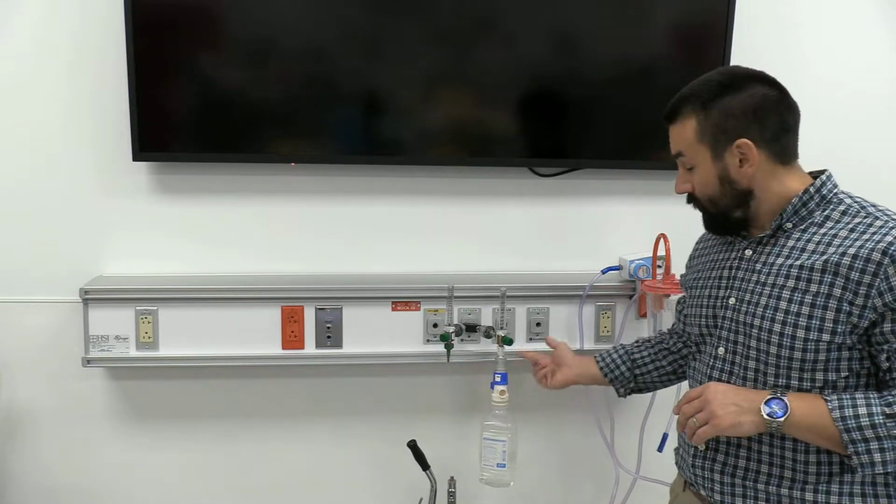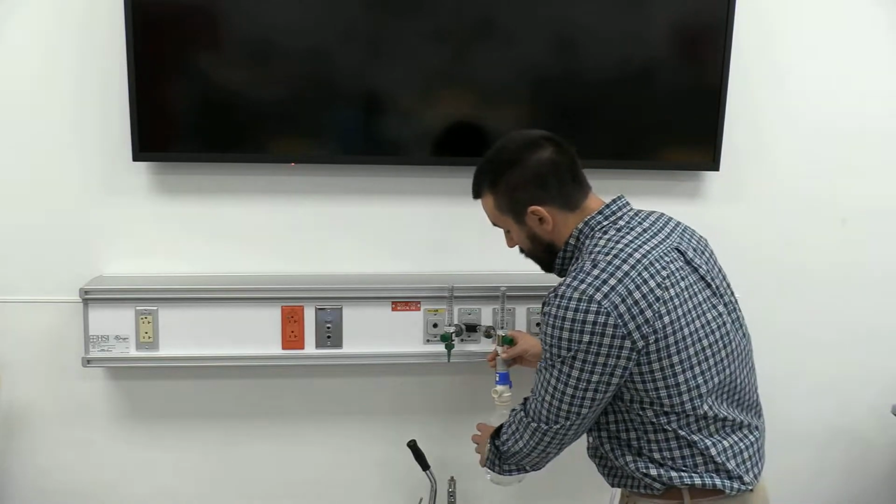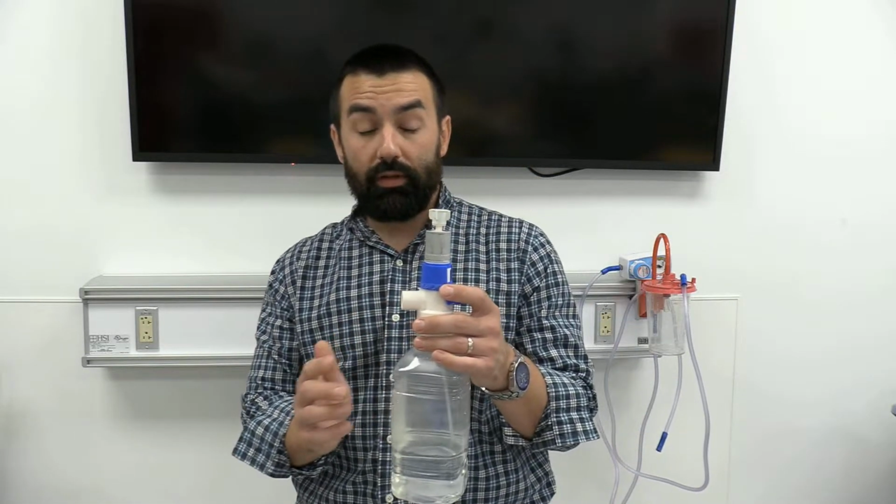So I got a liter bottle, same hookup here initially, okay? So I got this, have it set at 30%. All of our gas is gonna come out right through here, okay? So you notice this is a different diameter than everything else we've talked about up to this point.